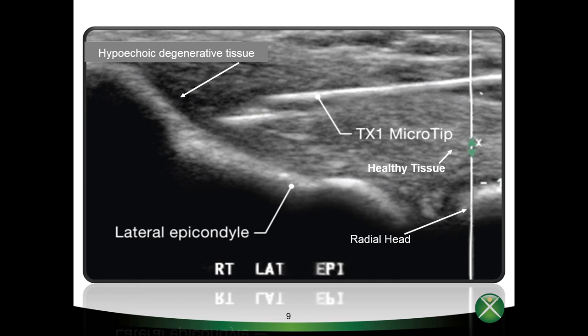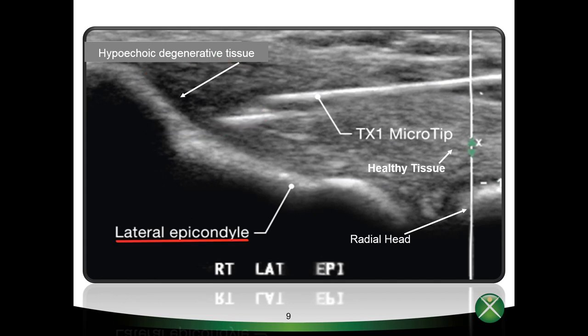Looking at the image on screen: on the right you can see the shape of the TX needle, which appears hyperechoic or white — remember, hyperechoic means that the ultrasonic waves do not transmit through a dense object such as bone or metal. The healthy tendon tissue is grayish in appearance. The hypoechoic or dark area noted at the tip of the needle is the diseased tendon that will be removed. You can also see the bone of the lateral epicondyle and the radial head, which are hyperechoic and appear white.